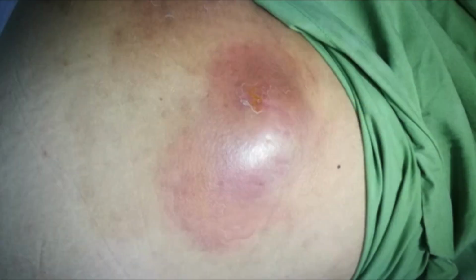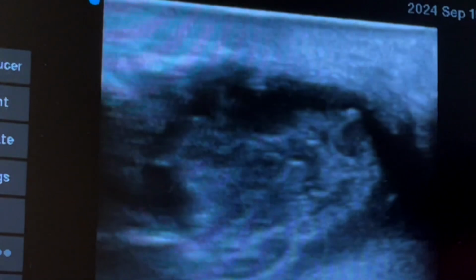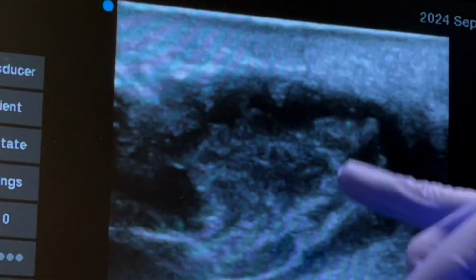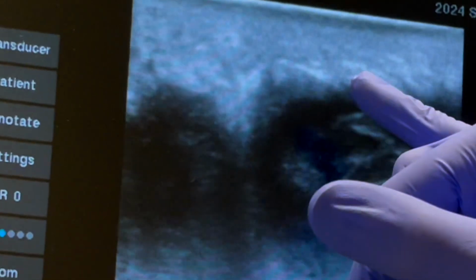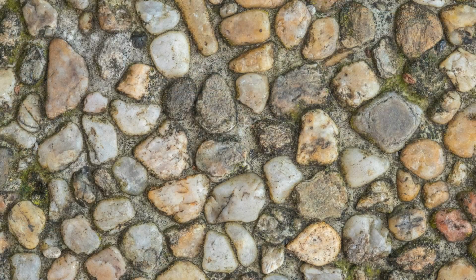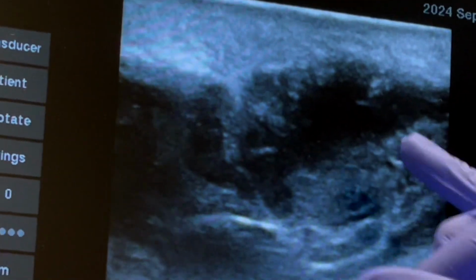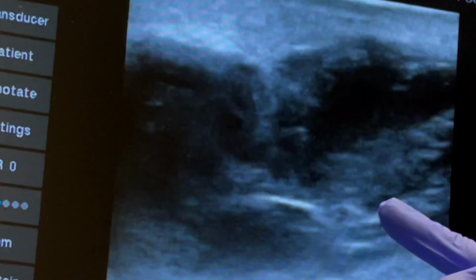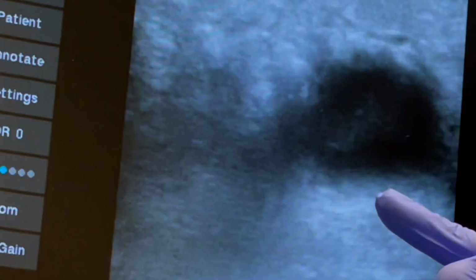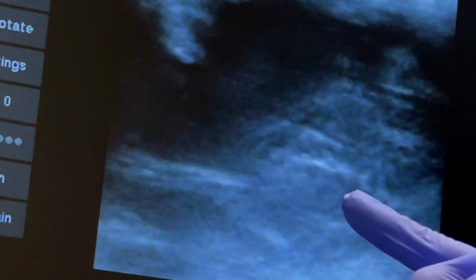All right, so when identifying an abscess, you run it over the area of interest here. And we found ourselves a fluid collection. It's a couple centimeters down, and we're kind of spanning throughout the skin here. There's some slight cobblestoning, which you'll see with some cellulitis, followed by fluid collection. You start to see the anechoic structures with some septal areas and some loculations. You span from left to right in a full plane, and you can see this is a pretty extensive abscess.